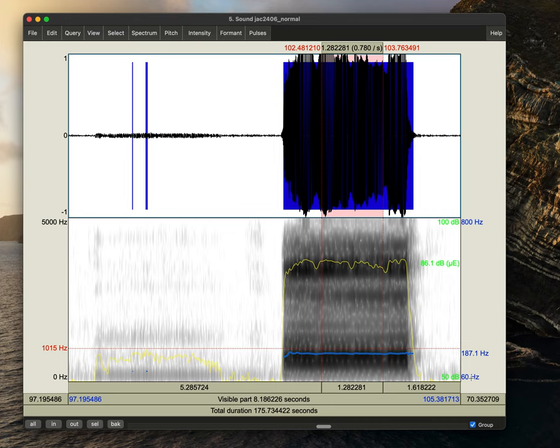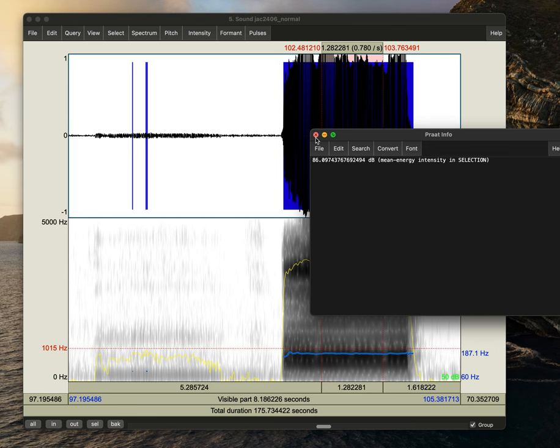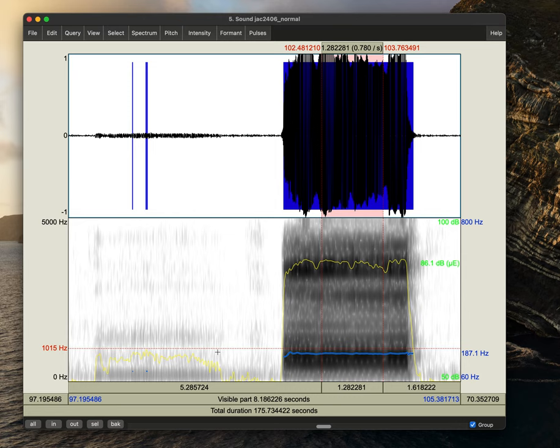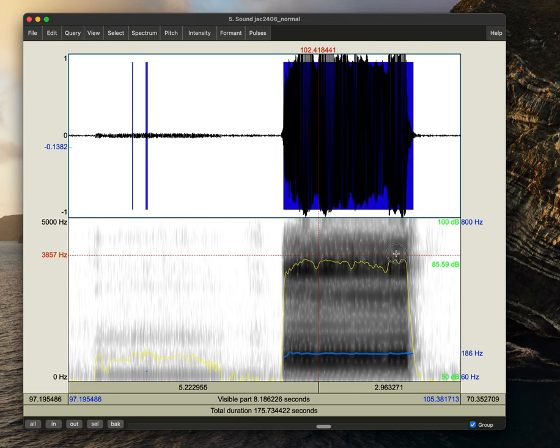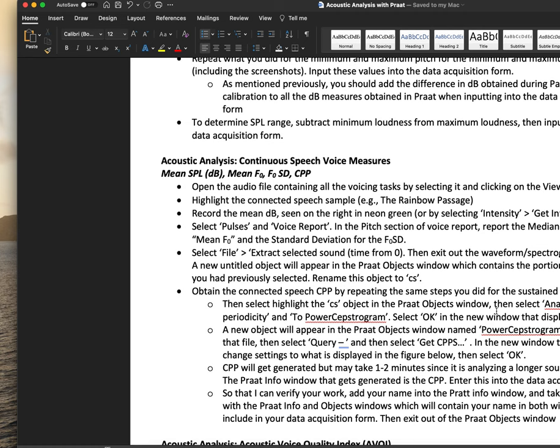We would do the same thing for our maximum intensity. 86.0, which is again what we see right here, 86.1. And that's because that just did some rounding, which we see here, 86.09. So that got rounded up. You'd want to make sure using your SPL calibration to add on top of this a difference of what we measured with our sound level meter with our praat numbers. So I had a difference of about five decibels. So my maximum intensity was in fact closer to 91 decibels and the minimum intensity was around 61 decibels.